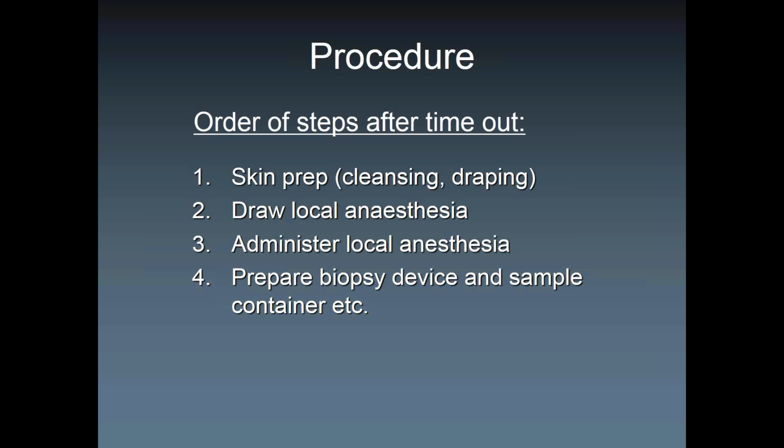You don't need to have the biopsy devices open because these are the most expensive part. You leave that for the end, before you're ready to really go in, because things can change, right? Patients can have a complication with anesthesia, or they change their mind, or they move around. You see, it's just not going to work. So you don't want to open the biopsy device before you're totally sure that you're really going to do the biopsy. So wait until you have even done the local anesthetic.